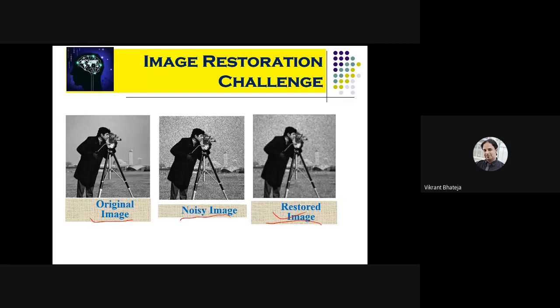So if I want to check back the quality of this restored image, what will I do? I will certainly compare this restored image to the original image, because my original image was very, very clear. Say this is my restored image, and when I compare it to my original image, I can certainly tell that say 80% restoration has been done, or say 70% restoration has been done.